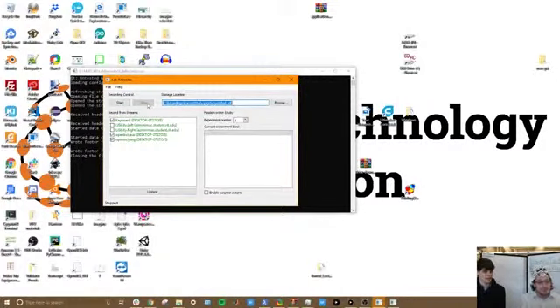So loud button presses. Yes. So you're going to start by pressing O. My eyes will stay closed, and no, before when we start recording. And another thing is, I can actually select which directory I want to save this in. So for our purposes, I'm going to put this in C/recordings/. I'm going to call this stream LSL.xdf.